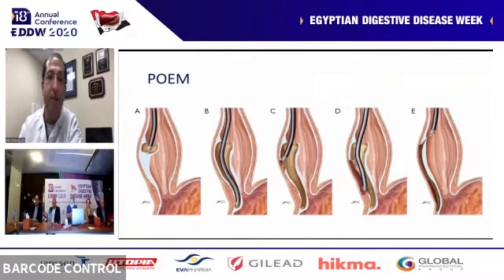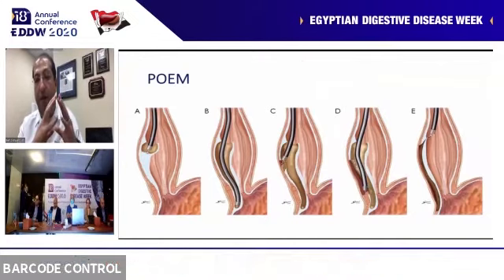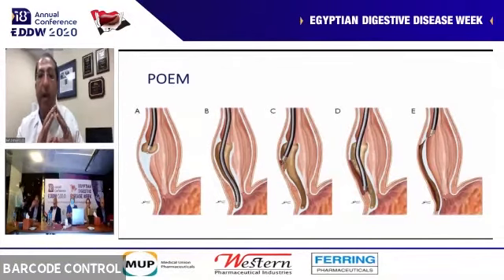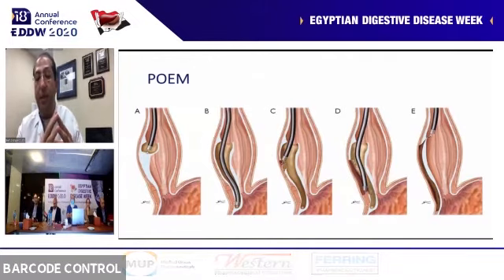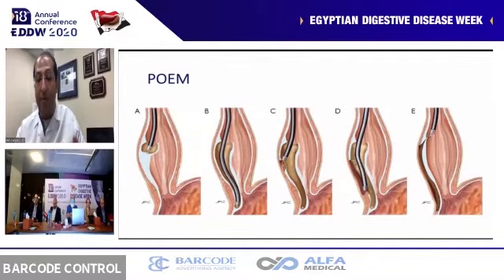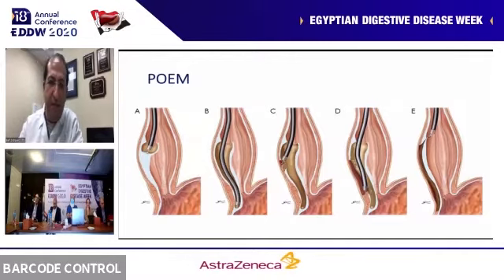It requires a lot of training, a lot of what I tell my fellows is very fine hand motor and eye coordination. You have to be very good endoscopically. If you're very good with ERCPs, with EMR, ESD, this is something for you to learn. It takes a lot of training. It takes a lot of understanding of where you are, what your surroundings are, where to start, what the pitfalls are, and how to perform this successfully and safely.